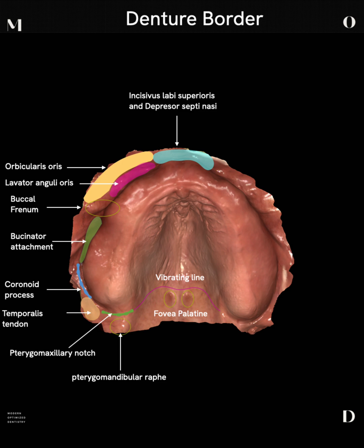We also have our coronoid process. Sometimes it's beneficial to have the patient just ever so slightly closed, which opens up that coronoid process area into the fossa back there. Then we have our buccinator muscle and its attachment at the mucogingival junction all the way along the molar-premolar area of our vestibule. Anteriorly, we terminate into the buccal frenum, which is usually located at the premolar area — something you want to scan under tension so you can see the actual muscle pleats as it attaches to the maxilla.